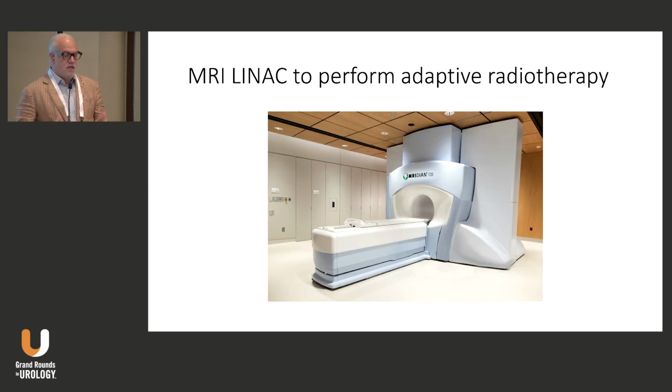And then the third thing that's gained a lot of interest is MR-Linac, which, the hallmark of MR-Linac, or why we're using and implementing MR-Linac. And just to know where I stand in this, at Mount Sinai we are actually getting one over the next year to 2 years. The plan right now is not really to use prostate as the main target for this, but we are. I'll go over what some of the unique tumor sites are. But this is just an example of an MR-Linac that is going to be able to use MR imaging to make the changes for the adaptation.